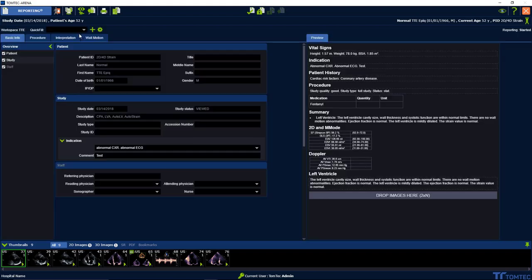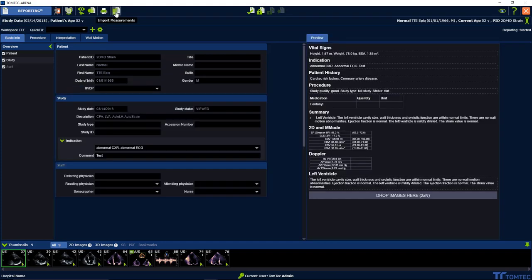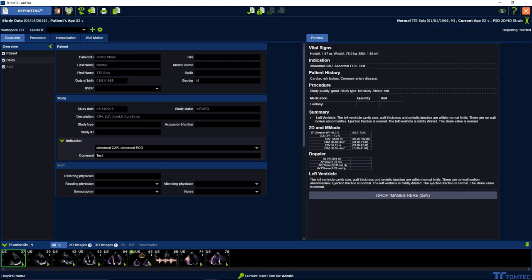Importing measurements from image com. Please click on the icon on the top: import measurements. To add further measurements here in the report, no problem. Please go back for image com. Perform your measurements from 2D and 3D, and then press the button import measurements again.